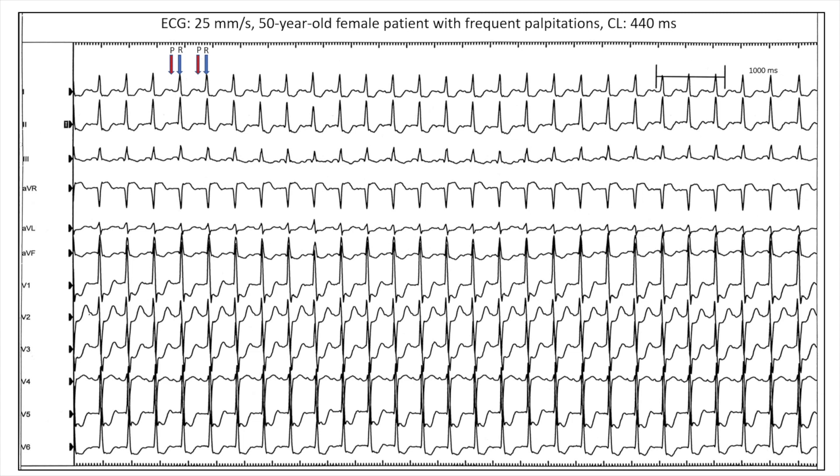We have a cycle length of 440 milliseconds. We see a one-to-one correlation between P and QRS, and we have a long RP, short PR tachycardia.